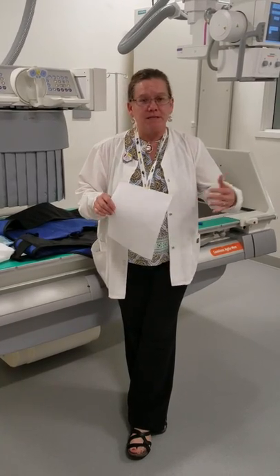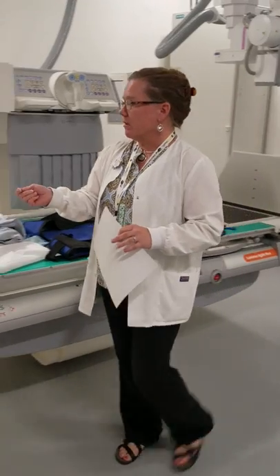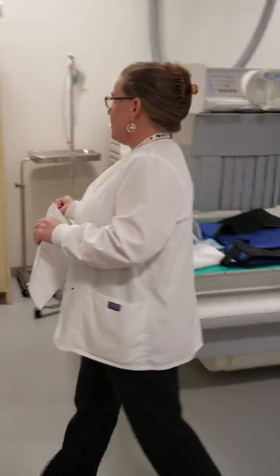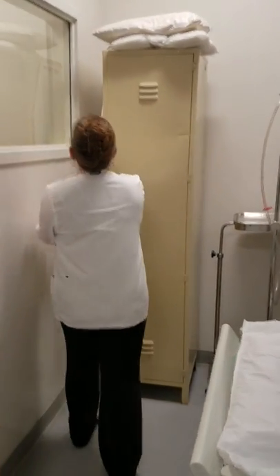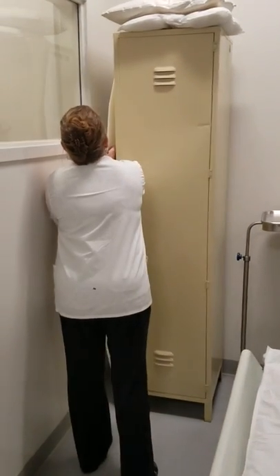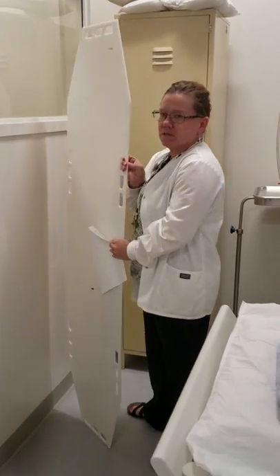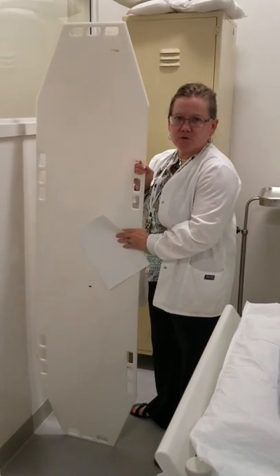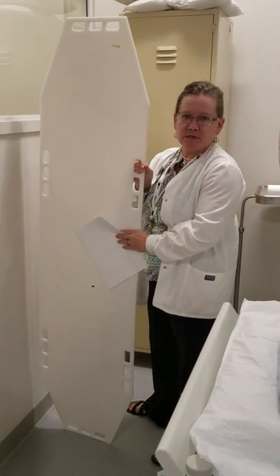If the patient is in a bed or on a stretcher, we might have to use an aid such as our glider — also called an easy mover. We can put it underneath our patients when they're on stretchers or beds and slide them onto the table. It's more comfortable for the patients.